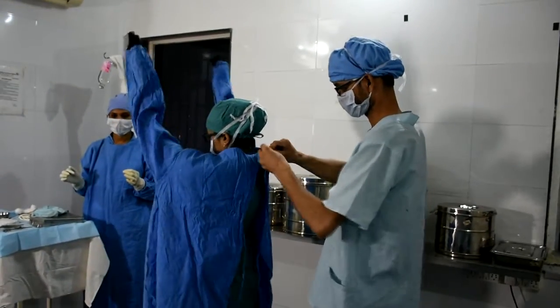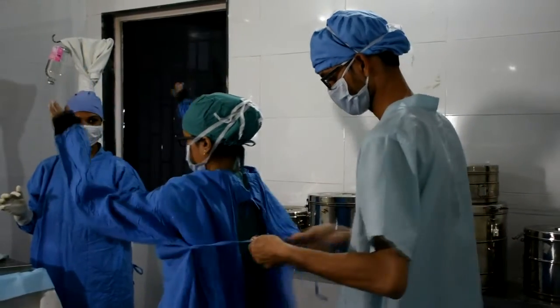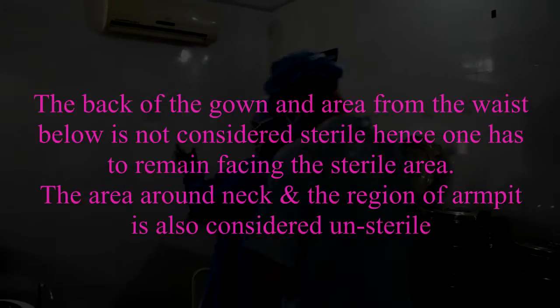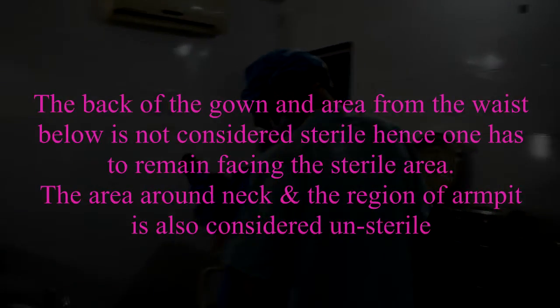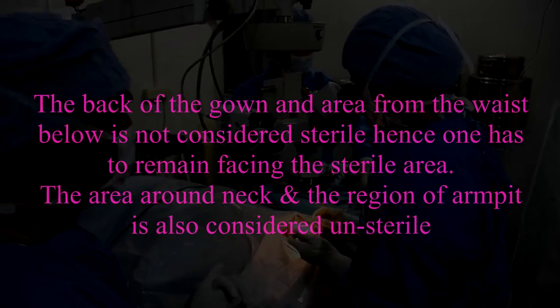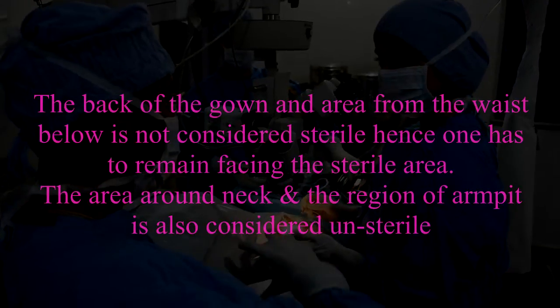When donning gowns and gloves, it is to be ensured that bare hands touch only the inside of the gown and gloves. The back of the gown and area from the waist below is not considered sterile, hence one has to remain facing the sterile area. The area around the neck and the region of the armpit is also considered unsterile.